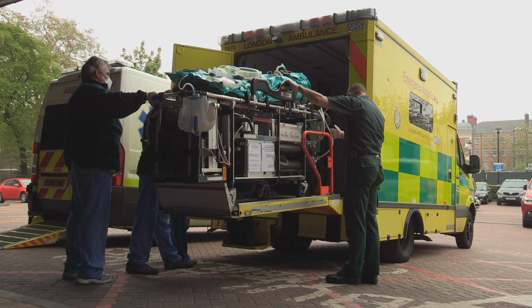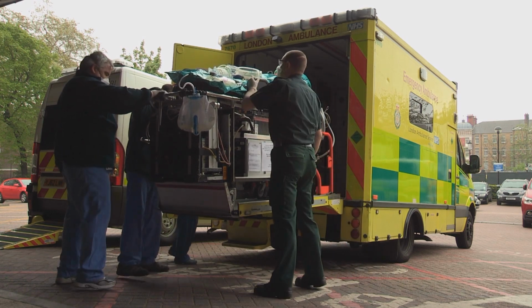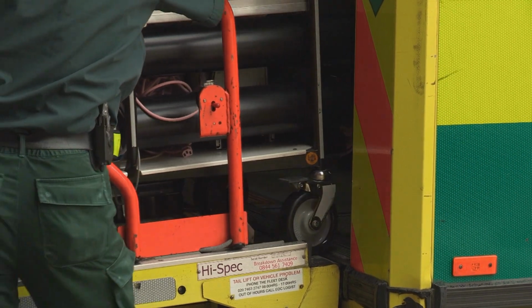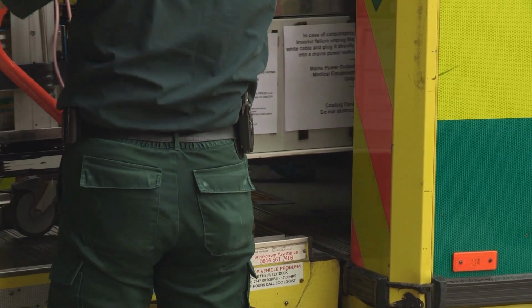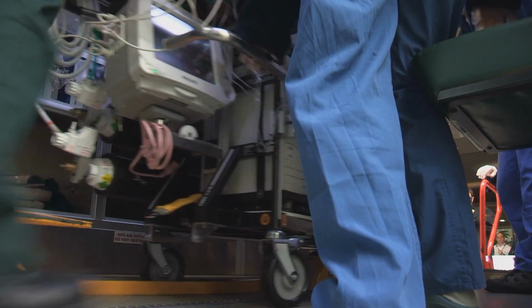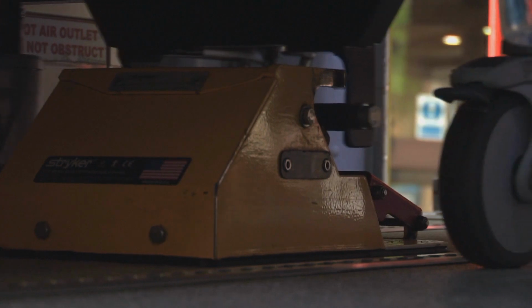Once the tail lift is level with the ambulance, make sure that staff are ready for the trolley to be moved into the vehicle. Due to the large volume of equipment, tubing and cables, each member of the team should confirm that they are ready to move. Then, slowly move the trolley into the vehicle and ensure it is locked into position.